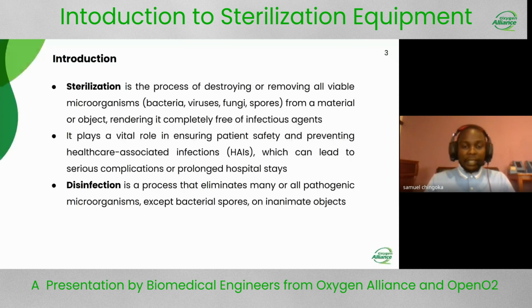When we say viable microorganisms, these are just microorganisms which reproduce, grow, and also carry out most of their cellular functions without a problem. Generally, these are infectious to humans, therefore we want to eliminate them, so we are using sterilization. Sterilization plays a very critical role in ensuring patient safety by preventing healthcare associated infections, which can lead to serious complications or prolonged hospital stays.